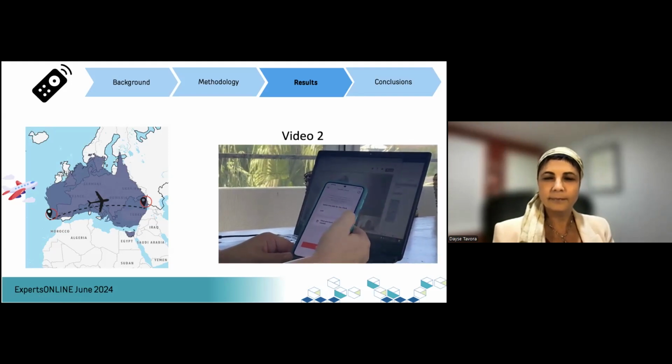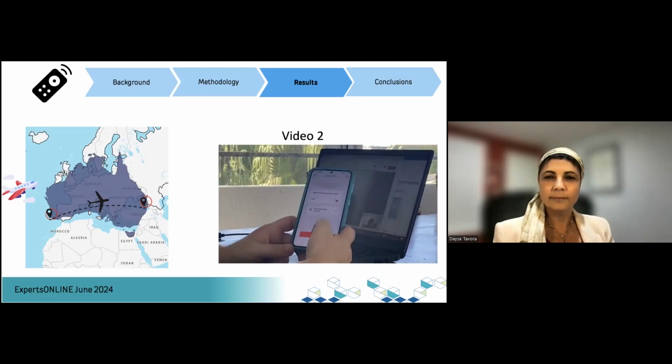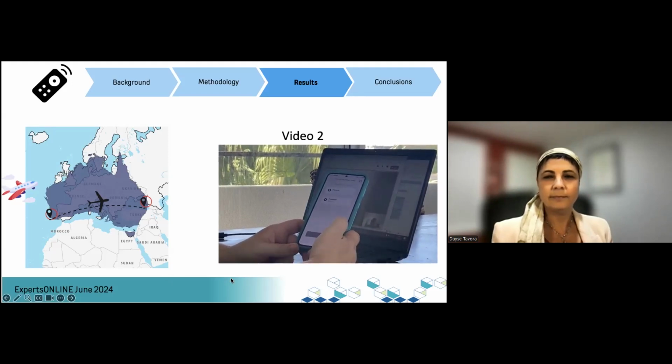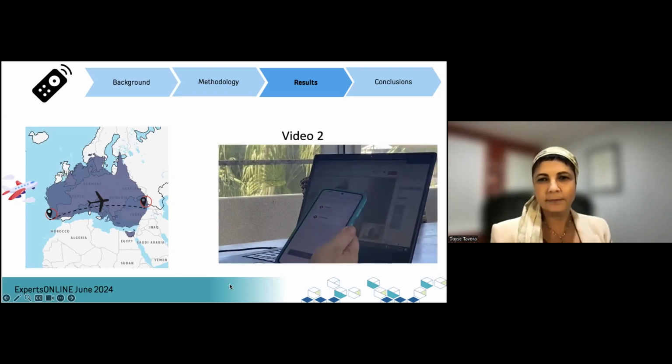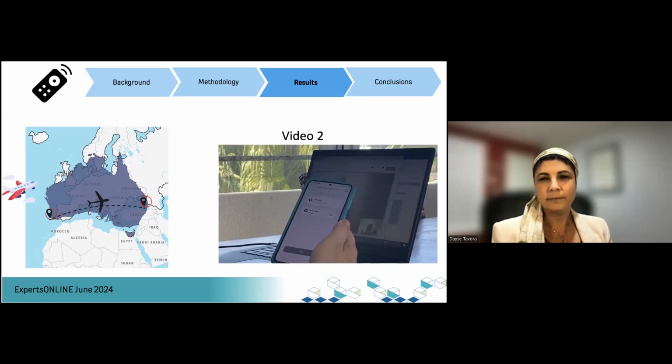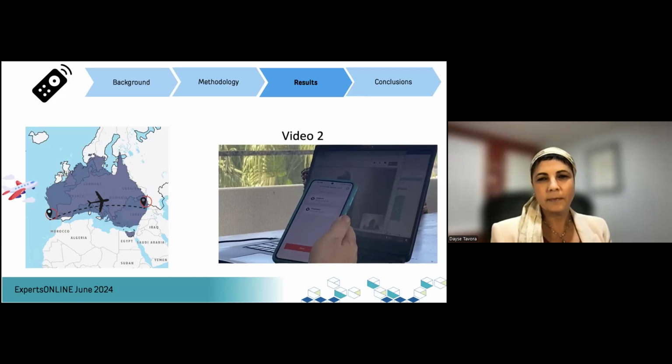That's correct, it's my left side. And I'm going to hit next. All right, and I'll hit start check. Oh, I got a green tick next to my implant. Good. Let's wait for the sound processor and I should be able to see it here on my screen as well. Okay. And I got another green tick.